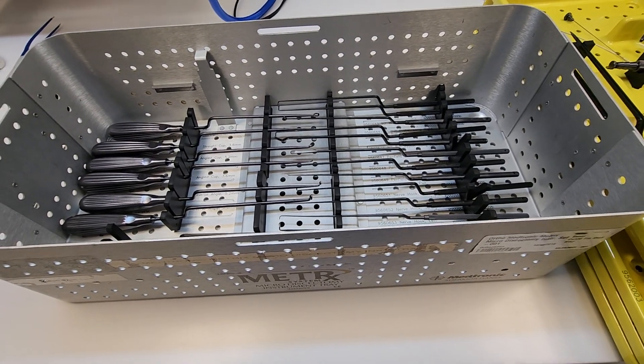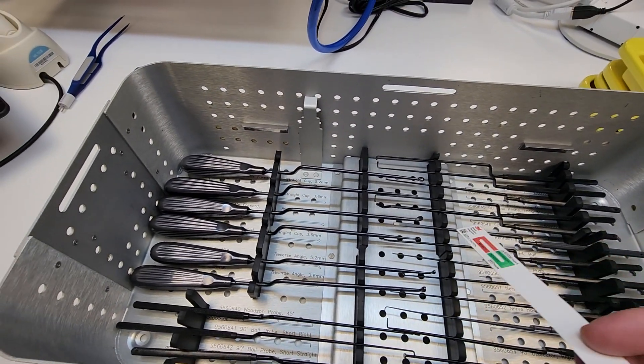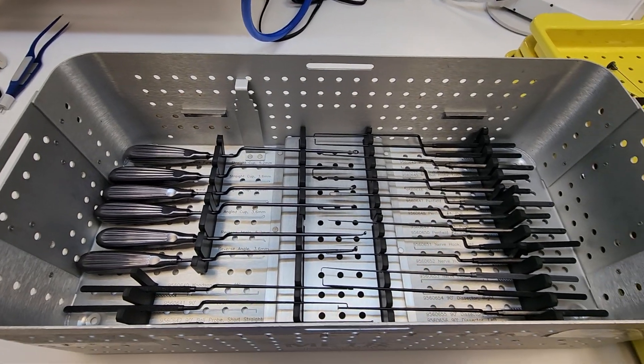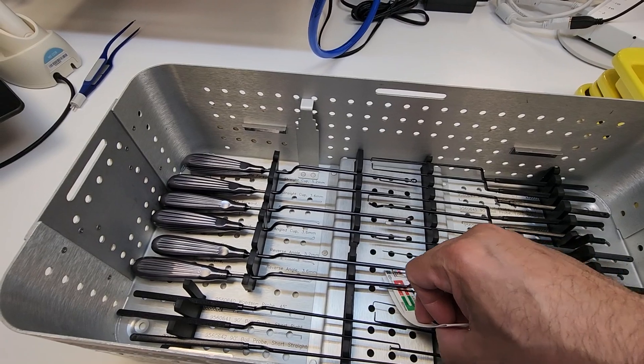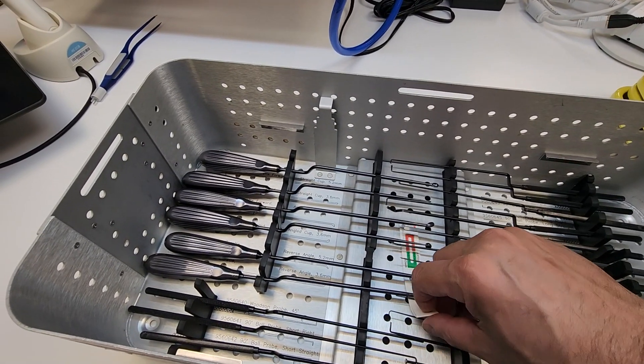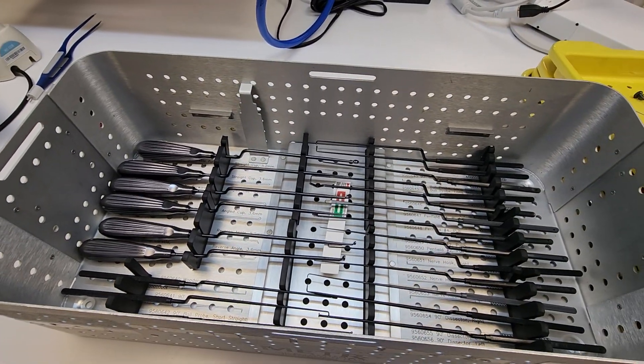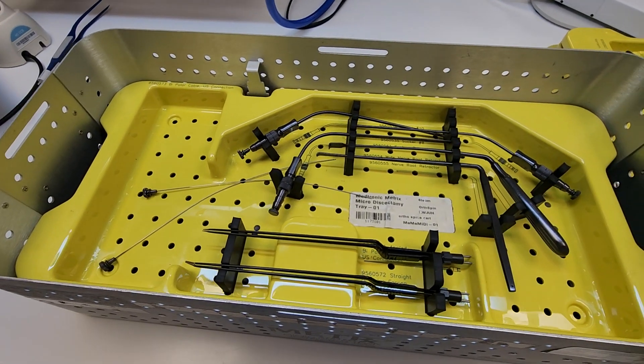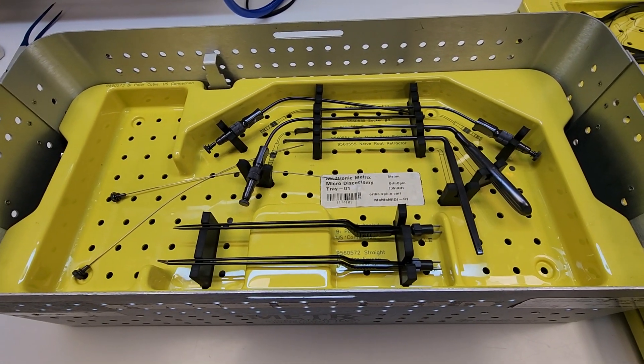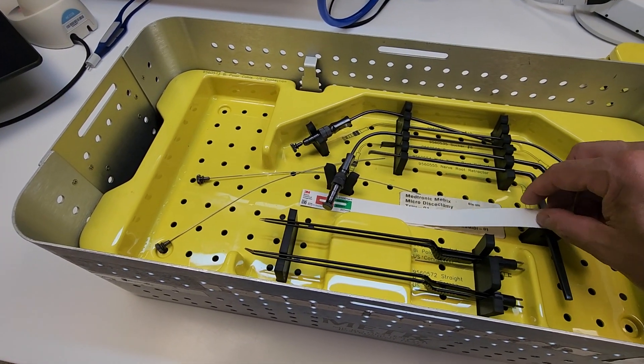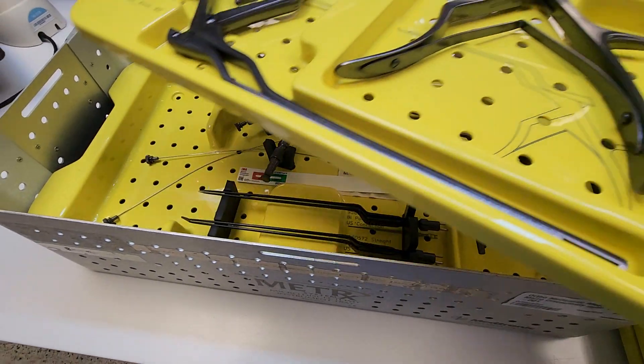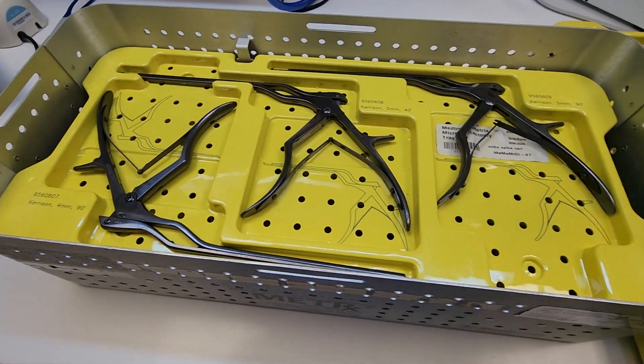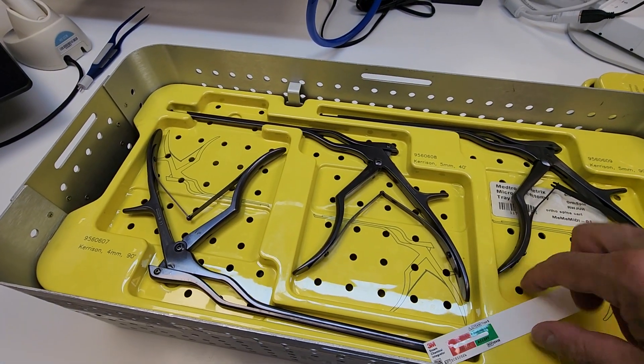If this is going to be wrapped in SMS wrap, according to the IFU of this indicator, we need to place one indicator technically in the geometric center of the tray that we can possibly place on each layer. So we have one indicator, we have two indicators, we have three indicators.